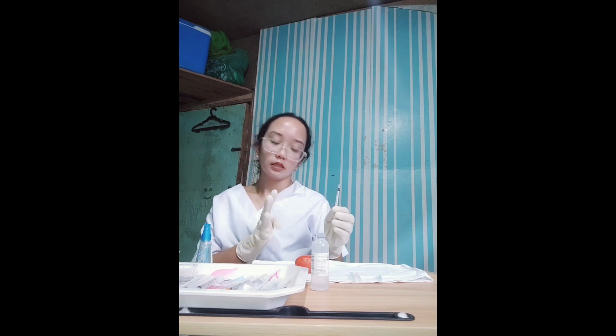So next, we will remove the needle cap, waiting for the antiseptic to dry. And we do this by pulling it off in a straight motion to decrease risk of accidental needle stick injury.